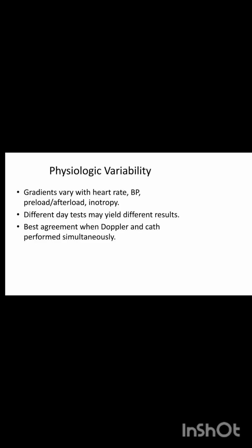If the patient comes one day with a high heart rate, the pressures will be high. If he comes another day with a low heart rate, the pressure will be low.